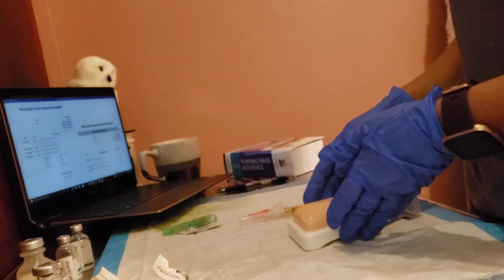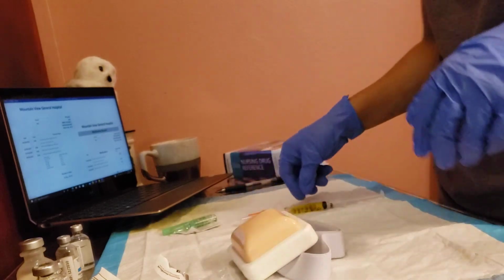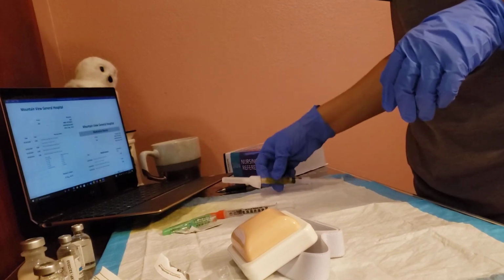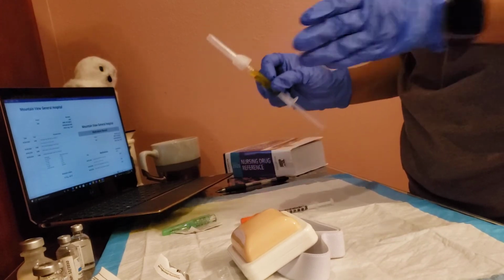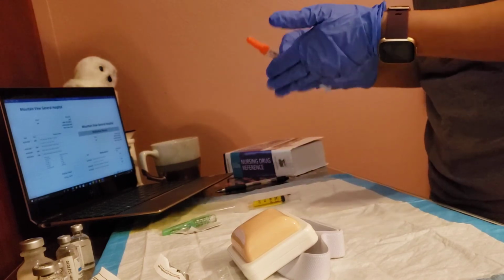My next one is going to be my Sub-Q, my antibiotic. And this one is going to go, sorry, not my Sub-Q, not my antibiotic. I'm gonna give my insulin second. I'm gonna go Sub-Q with my insulin.